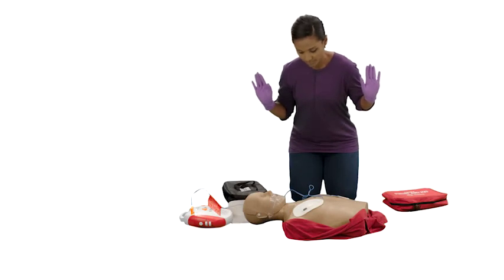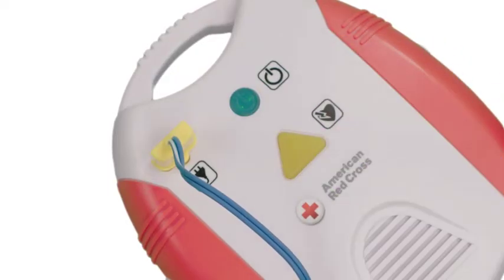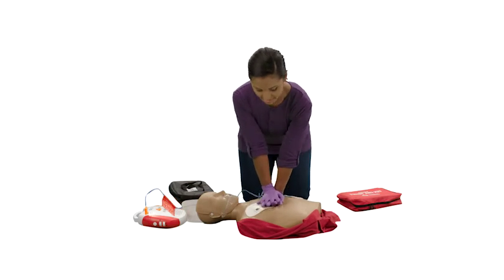To do this, make sure no one, including you, is touching the person. Again, say, "Clear," in a loud, commanding voice. Push the shock button to deliver the shock. Shock delivered. After the AED delivers the shock, or if no shock is advised, immediately begin CPR starting with compressions.